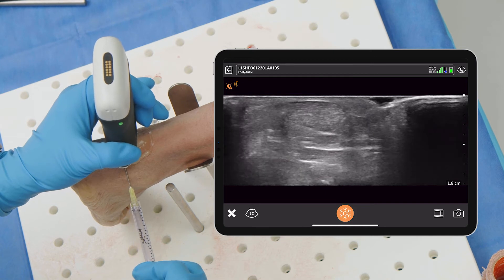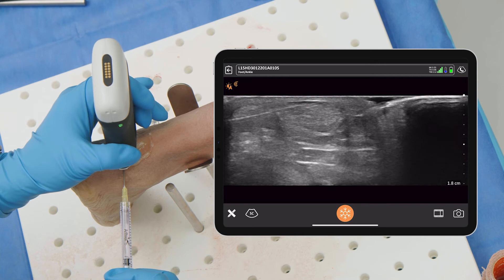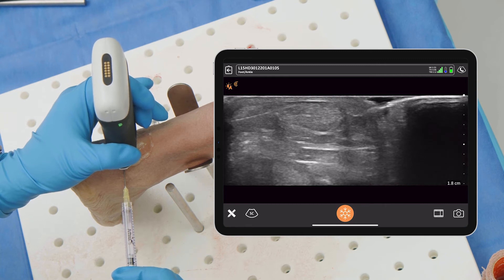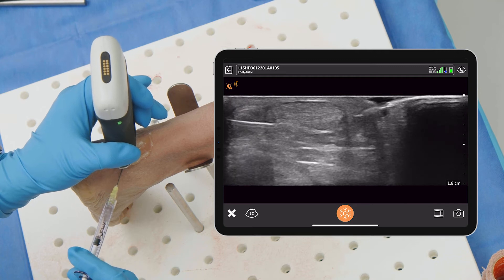If you want to localize and go superficial, that's easy to do. You can go superficial on the proximal aspect, or you can go deep as well and get under it. So you can actually really surround it if you want.